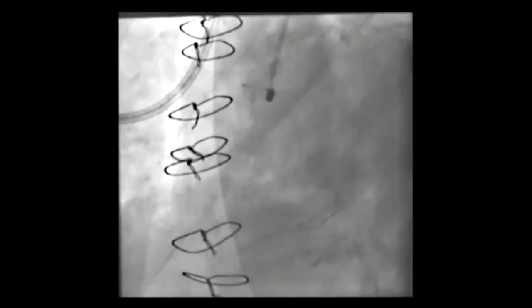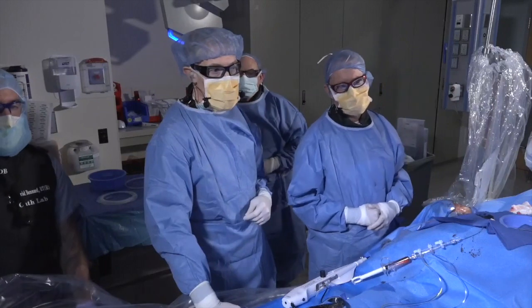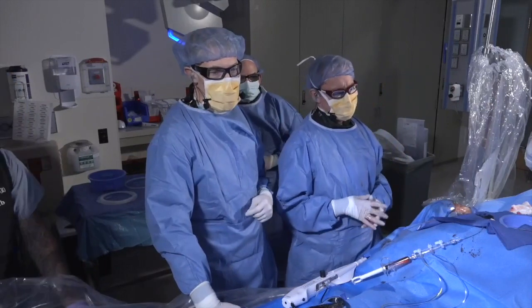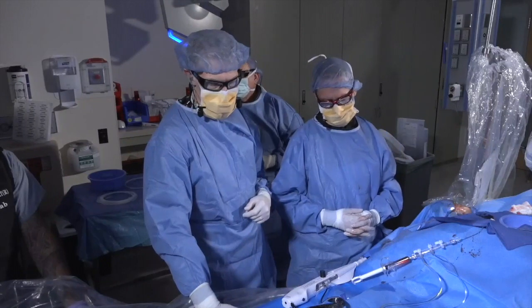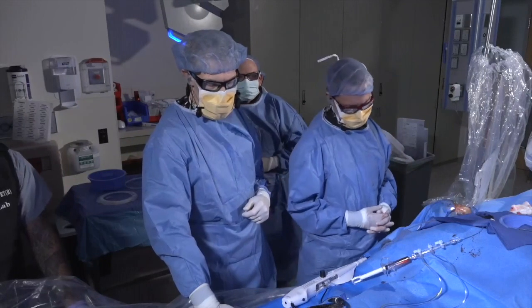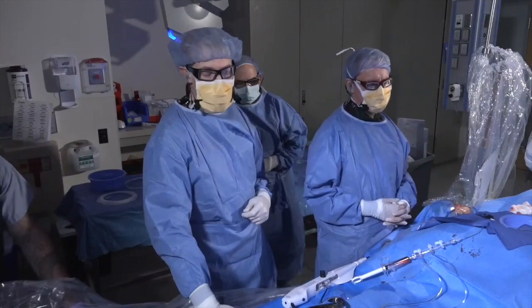Next. So really quick for the audience, just give me 1 second. Those images, the distal reference determines the size of the vessel. You just measure across it and you'll know what the size is. And that ostial image, because the calcium was less than 180 degrees, suggests that you don't have to do atherectomy. You could prep it with a specialty balloon or a non-compliant balloon and get a good result. And it seems that's what you ended up doing because I saw a balloon inflation.